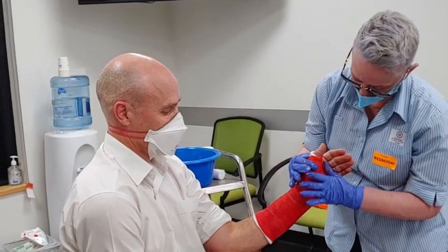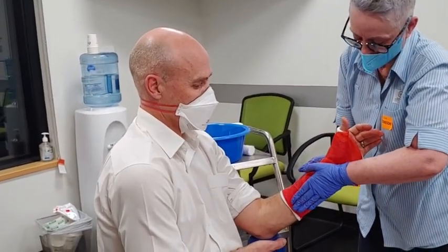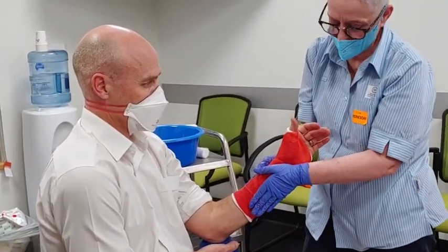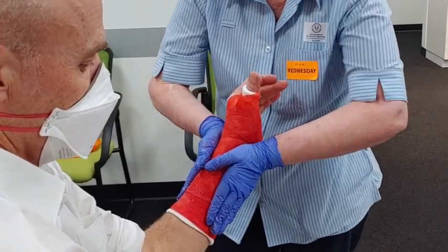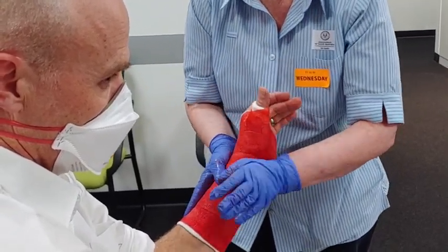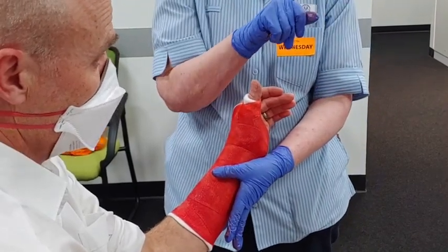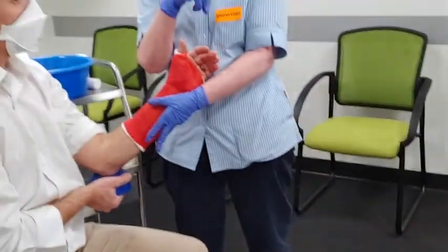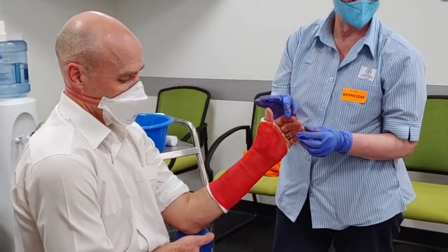Take the time to actually mould. Notice how the arm's not rotating at all. This is a three-point moulding: one across the top, two here, and a point to make sure the cast is in contact with the skin — contact moulding from both sides. Push from both sides so you see a really good shape of the hand, almost as if you've stuck them in wax and taken them out. Smooth it off so it's flat — this prevents rotation as well as extension and flexion of the wrist. Check the neurovascular status and you're done.